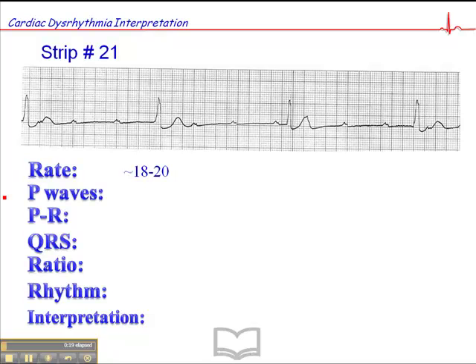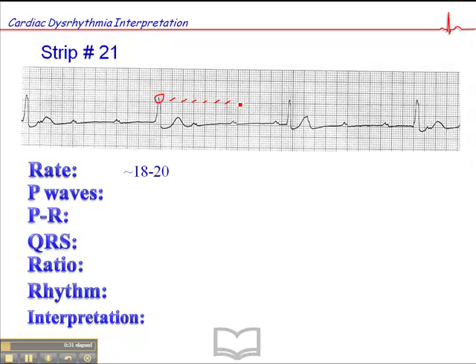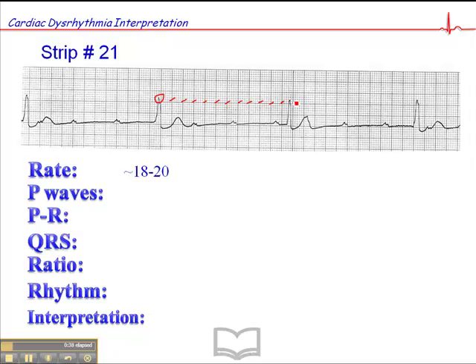If we were to map it out and measure it, this QRS falls fairly close to a dark line. So that's 300, 150, 100, 75, 60, 50, 43, 37, 33, 30, 27, 25 — maybe even slightly more than 25.